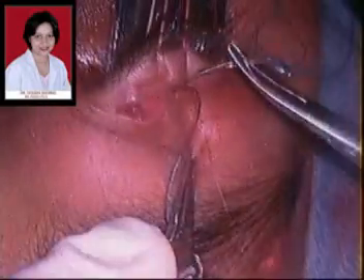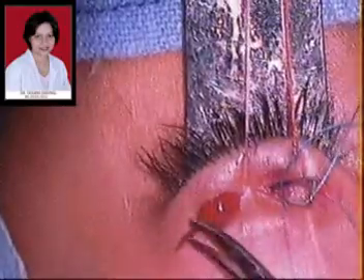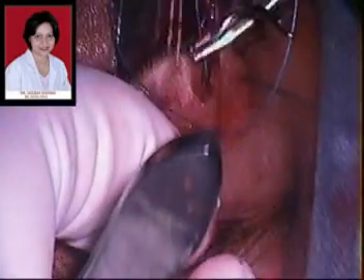We then pass the 4-0 ethibond suture through the lid incisions at the level of the tarsal plate. The correct depth is crucial because placing it too deep or too superficial can result in entropion or ectropion. After passing through the lid incisions, this suture is then passed into the suprabrow incision below the orbicularis muscle, and the suture track should be visible while passing it to ensure it is not too deep or too superficial.